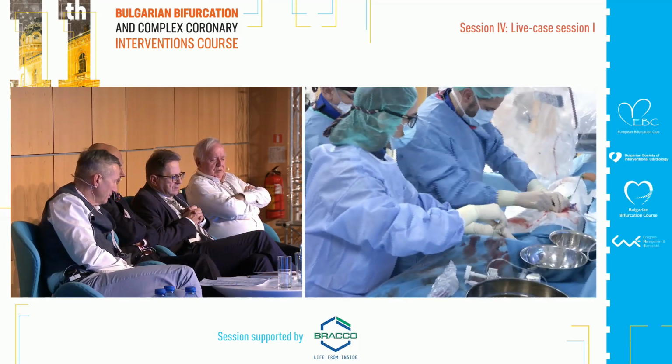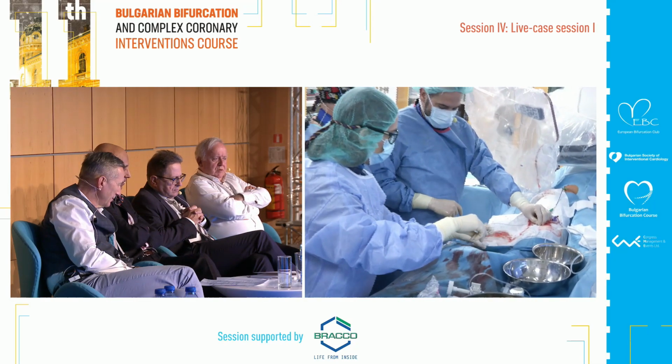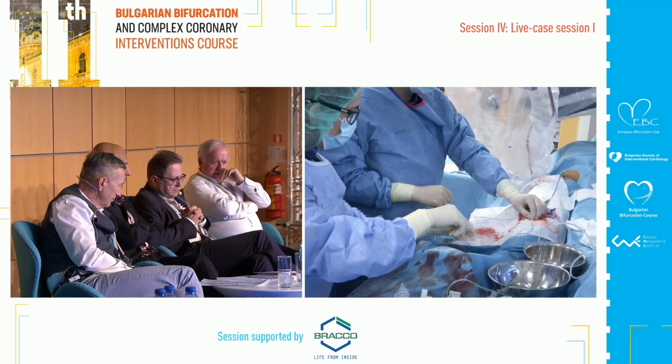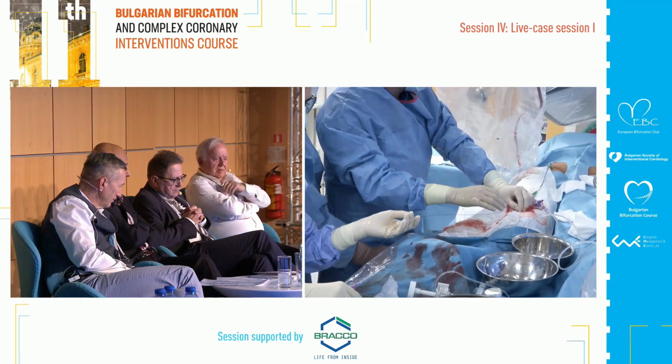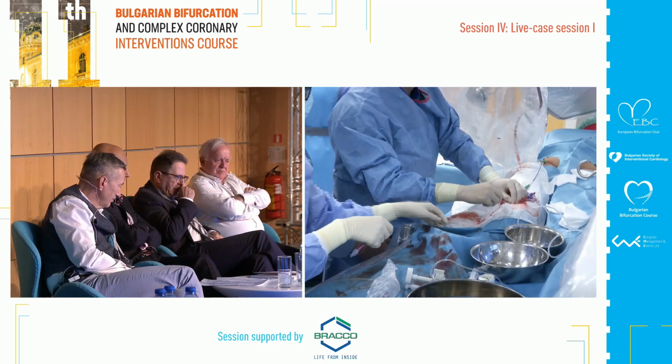I mean, you do what you want, but I think the long stent makes more sense. You don't want to overlap stents over a diagonal, because then if the diagonal is lost, it will be very hard to get into it.